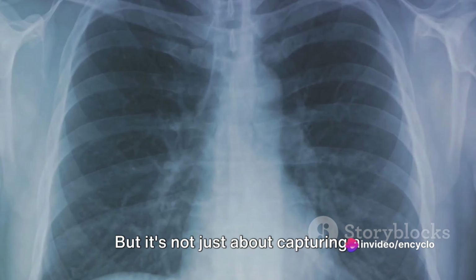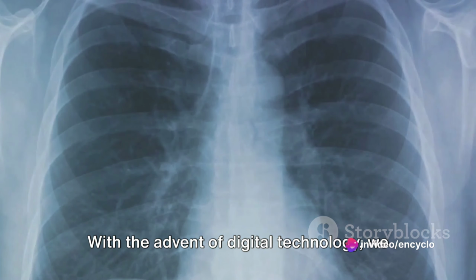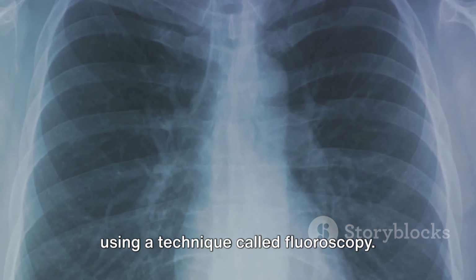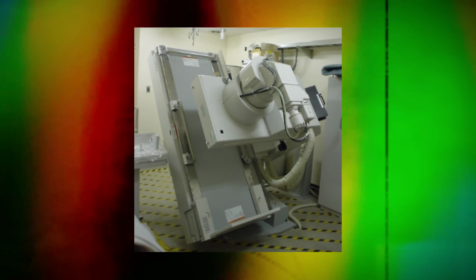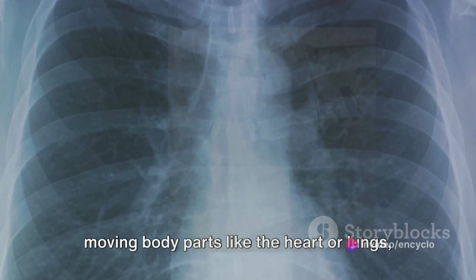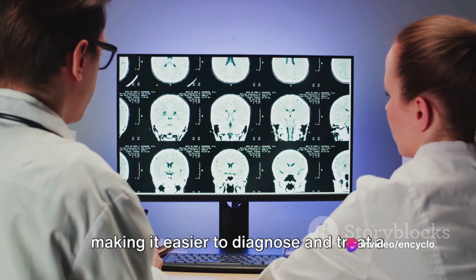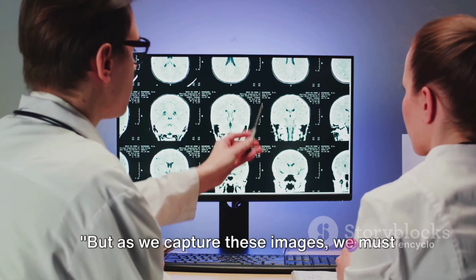But it's not just about capturing a static image. With the advent of digital technology, we can now create real-time moving images using a technique called fluoroscopy. This gives doctors the ability to view moving body parts like the heart or lungs, making it easier to diagnose and treat a range of conditions.